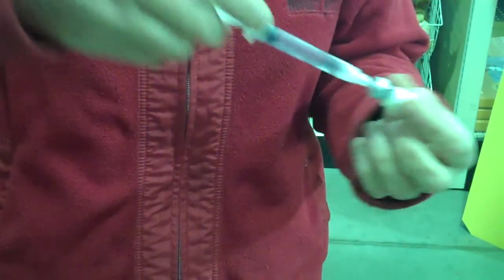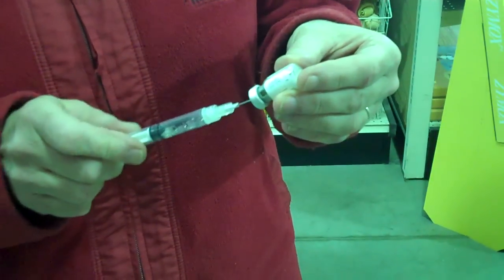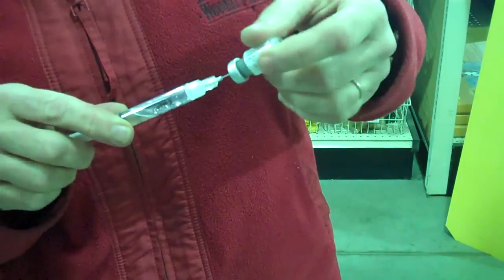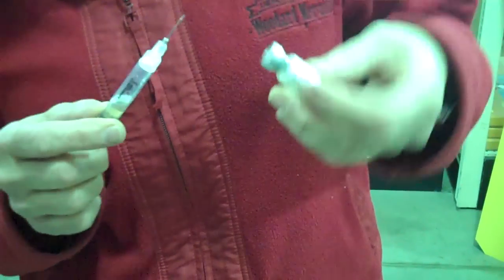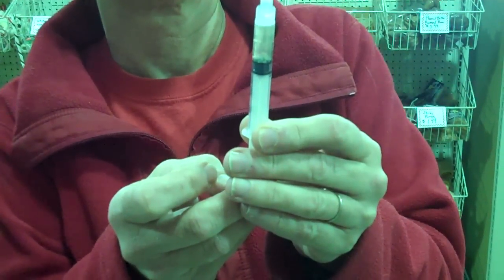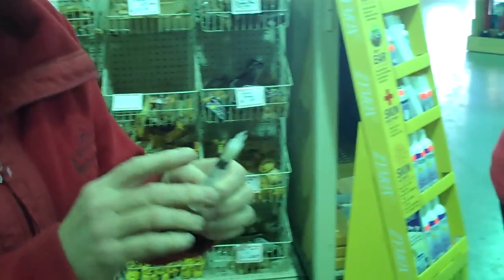Now let air back into the needle and then pump it into the vial there and draw out your vaccine. Make sure you get all of it out of there. Next is making sure you get all the air out of the syringe — that is not good to have any air in there. Make sure you flick it a couple times, get those air bubbles to float to the top so you're getting nothing but liquid out the top.